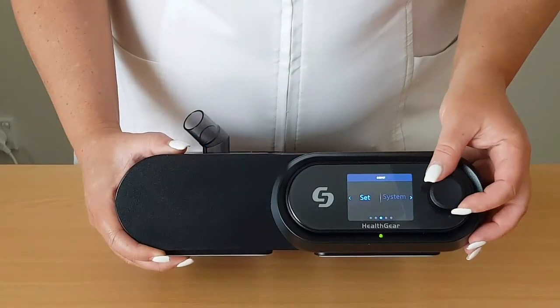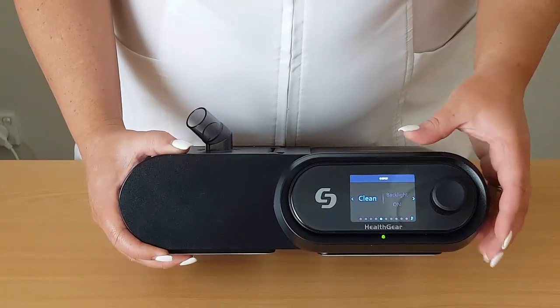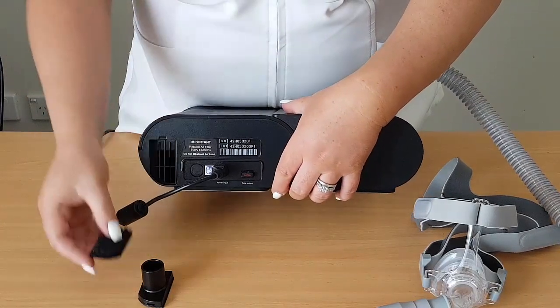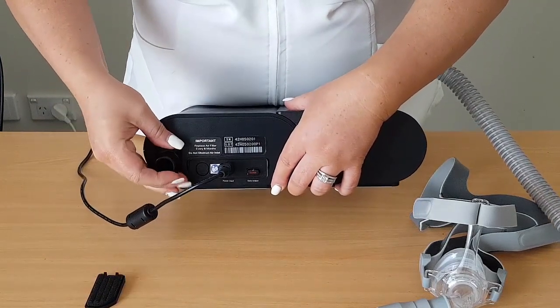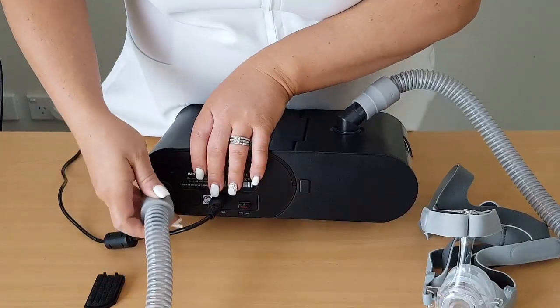In an Australian first, this machine features an inbuilt ozone cleaner. To clean your machine, you first must remove the air filter cover along with the filter and replace it with the ozone joint adapter. Then remove your mask from the hose and connect the hose to the ozone joint adapter.